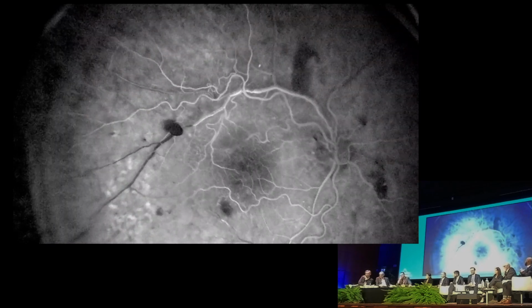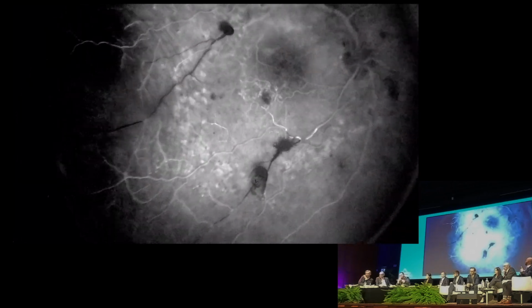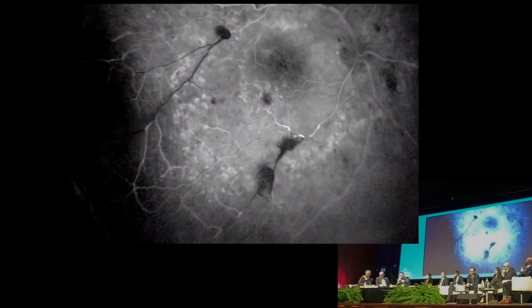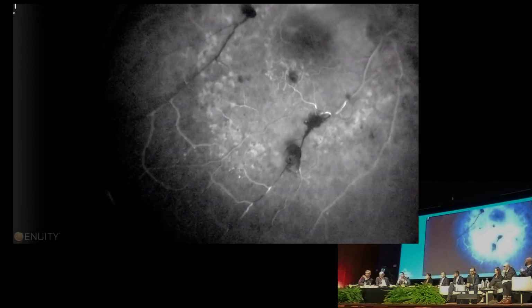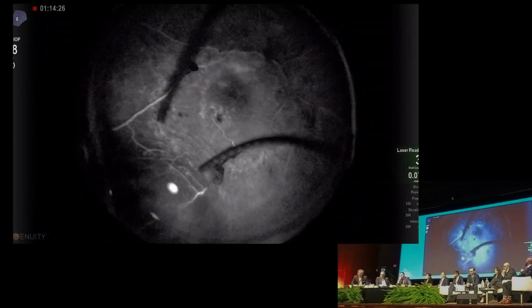This is a venous flow. You can see the embolus there. So the venous congestion is an interesting phenomenon because during the indentation there is a reperfusion of this particular vein. So these are phenomena which actually occur in the eye, but we don't see them without vascular imaging.